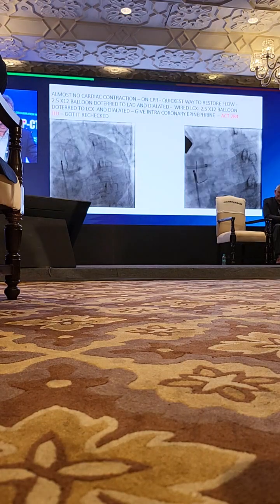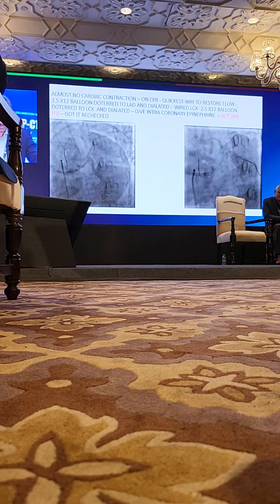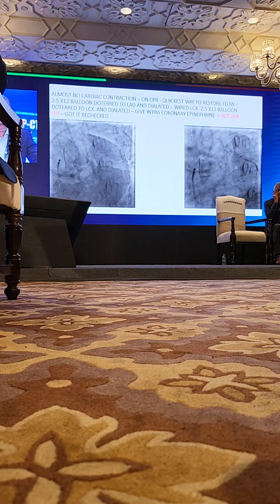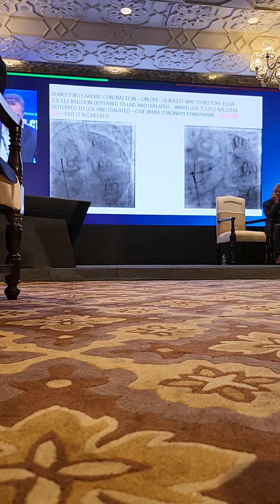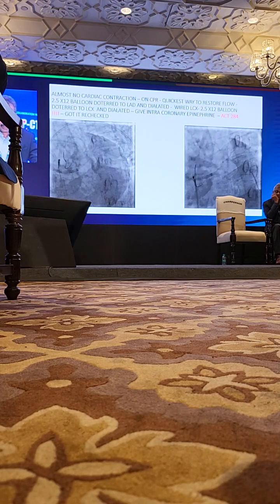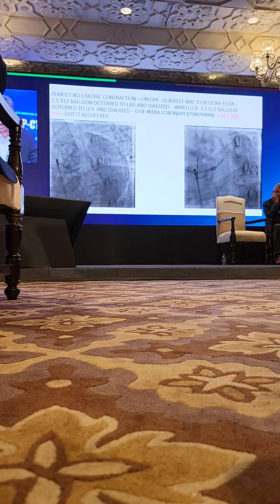So all these possibilities are in the back of the mind. Our team gets activated. The anesthetist takes care of the CPR as well as the intubation. You can see there is no cardiac contraction at all on CPR; this is a view in between CPR. We quickly try to restore flow. We take a 2.5 by 12 balloon to the LAD, and we quickly wire the LCX, the flowing vessel. We wire the LCX again, take a 2.5 by 12 balloon into the LCX and dilate. Still no recovery. We give intracoronary epinephrine, which is a lifesaver in all these scenarios.